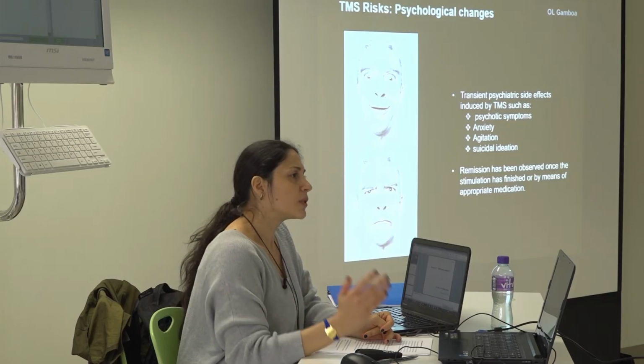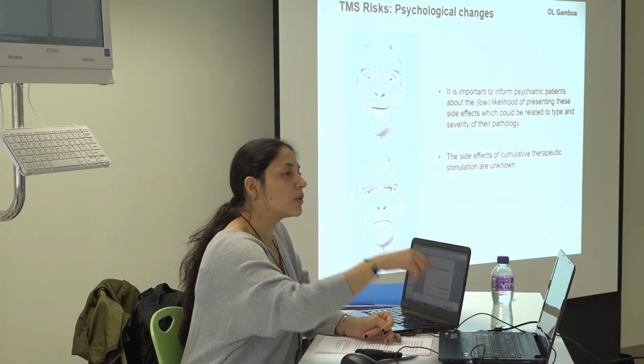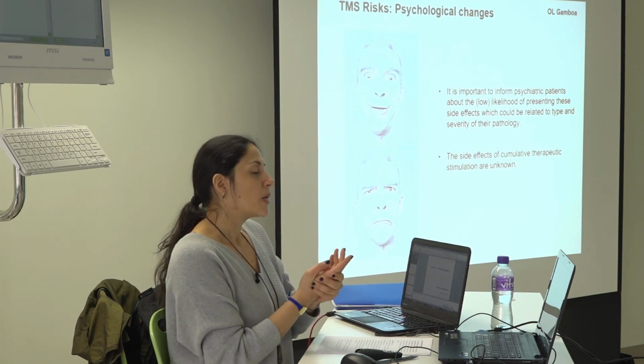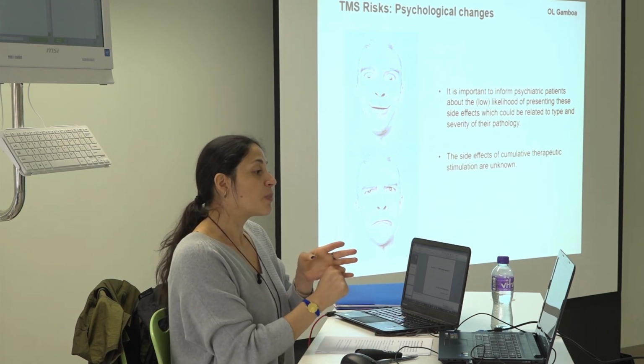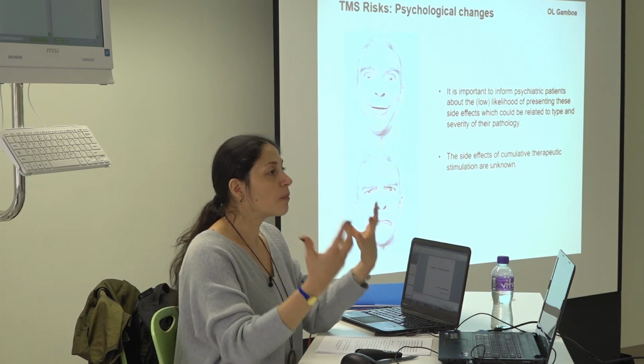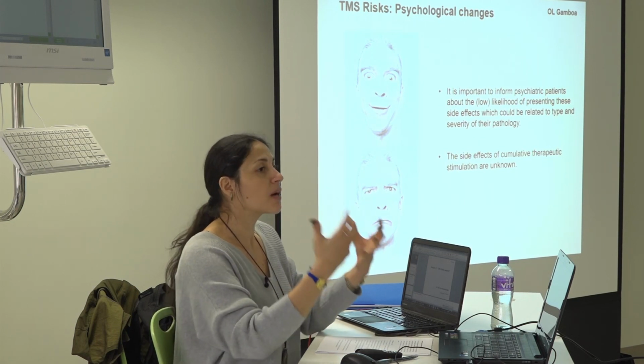But it's really important that when you are going to do this type of treatment, when you work with pathological patients, you need to take care with it. You need to observe. You need to inform them that psychiatric patients can have these effects. It's very important that they know, so they can make an objective and well-informed decision about whether they want to take part in the study or the treatment.